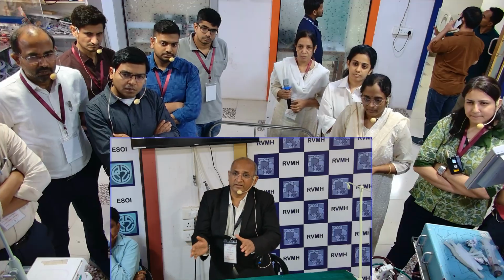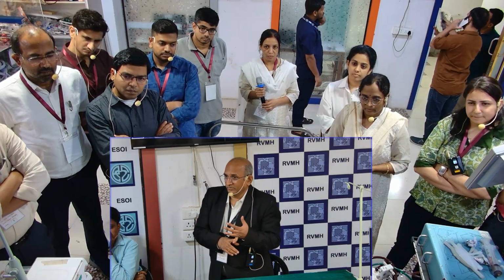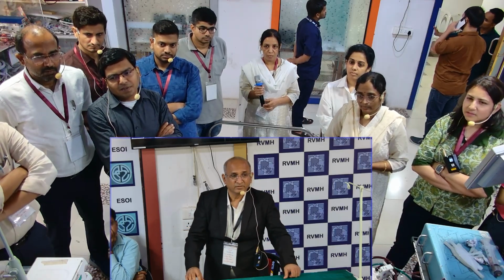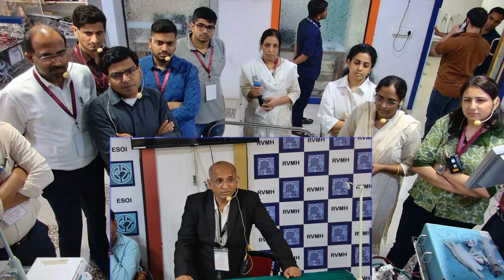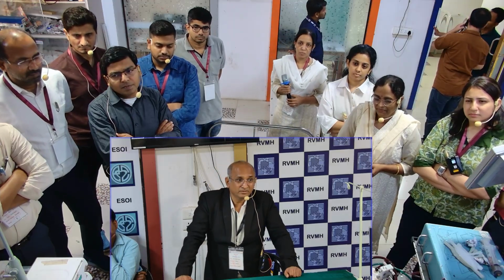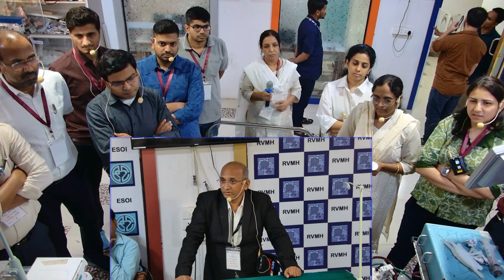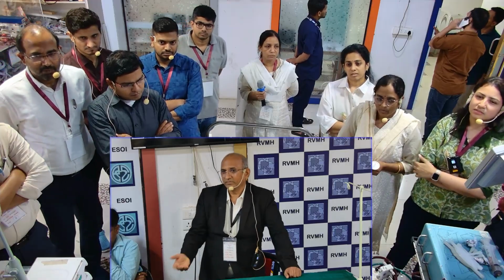I don't know why you are getting distracted to the patient when there's nothing wrong with the circuit pressures. Okay, there's no point in thinking about pneumothorax or anything. Bilateral decreased air entry. In ARDS, what are you going to get? In ARDS requiring ECMO, do you expect good bilateral air entry? The lung compliance is poor. So we have to know the trend, how it was yesterday, and is it the same today? Maybe it was the same yesterday. Circuit pressures? No, sir, the air entry. Probably it was the same in the morning.